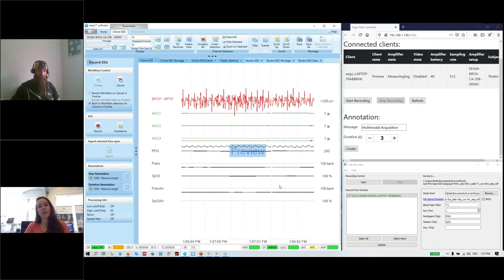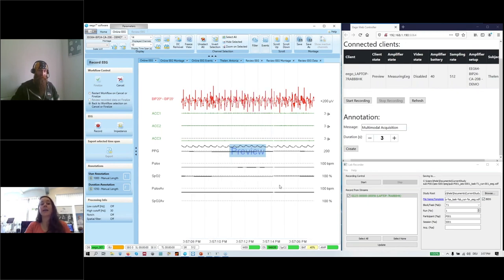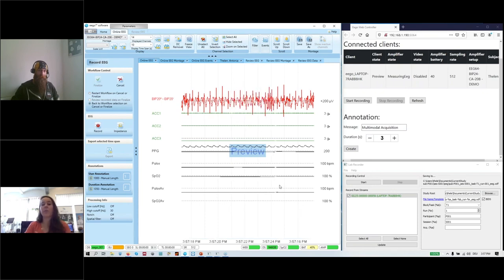Sam showed us how we can integrate the signal from the Tobii glasses directly into our EEG recordings via TTL triggers. Nonetheless, I would like to point out that we also permit adding simple things such as bipolar channels. So up here on the upper line, the red line, is a bipolar recording of my ECG. I attached two bipolar electrodes to my shoulders. If you don't believe me, here they move. So you can actually see my heartbeat in real time.